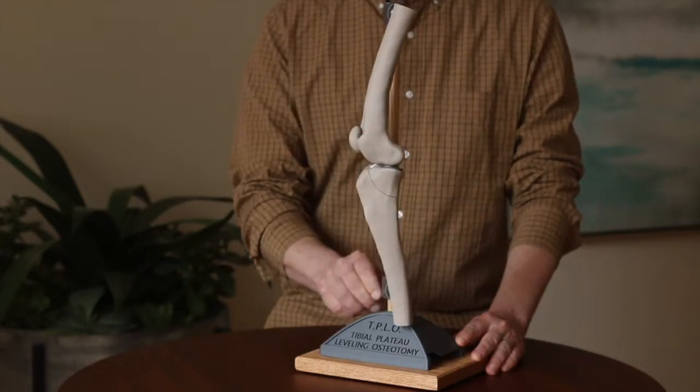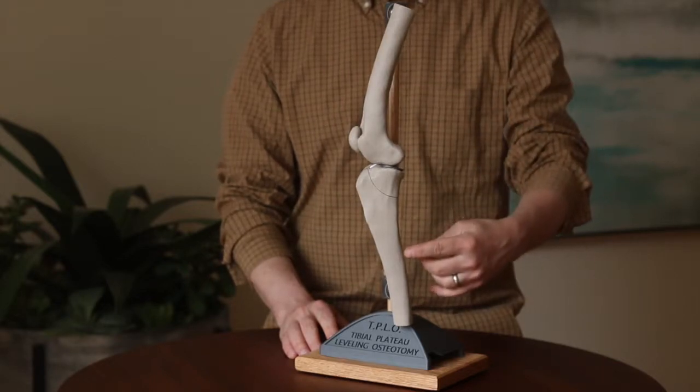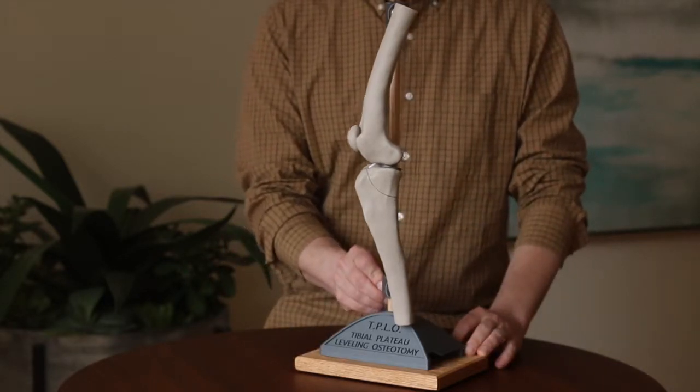In humans we stand with the femur on top of the tibia in this position, but dogs stand at an angle of approximately that much.